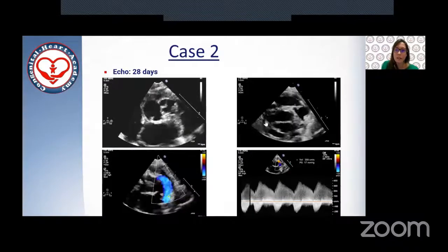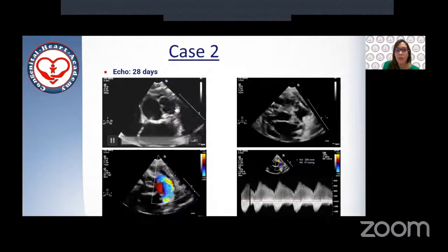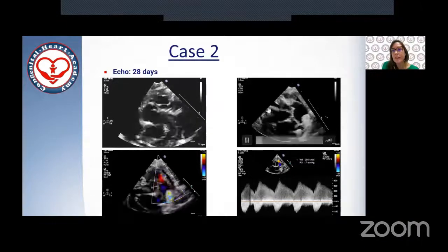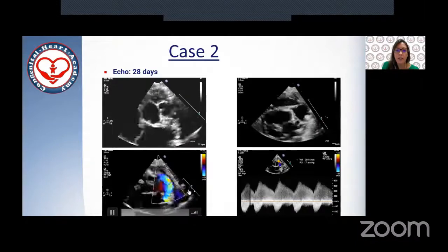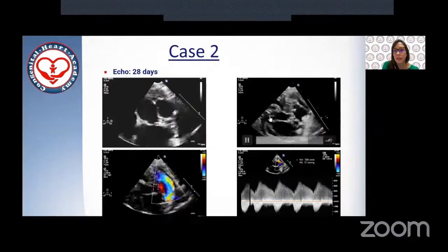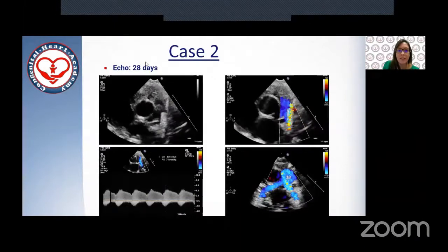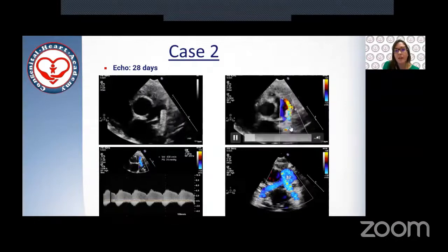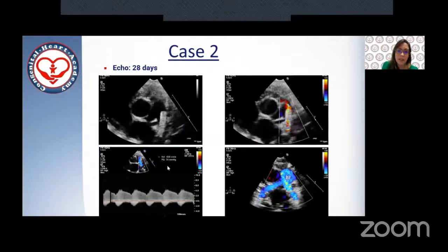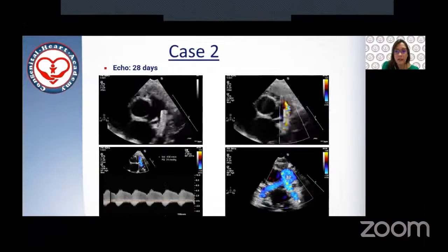And here, we can see the aorta and the pulmonary valve with the lifted leaflets with movements. There is a residual small obstruction and a gradient of 17, with a mild regurgitation and a vigorous contraction of the outflow tract. And at last, here is the aorta, the pulmonary artery, and the stent in the ductus with a flow from the aorta to the pulmonary artery with restriction and a gradient of 74. The pulmonary arteries have good size.